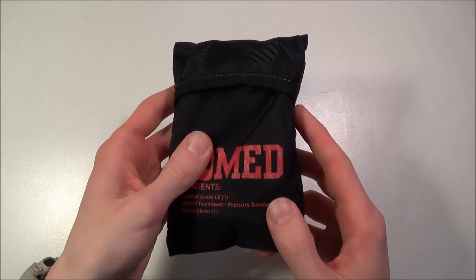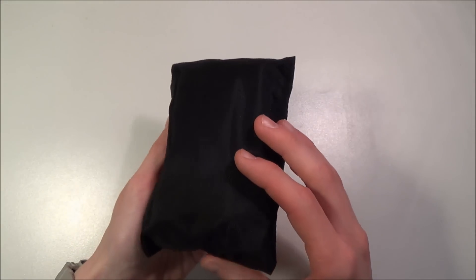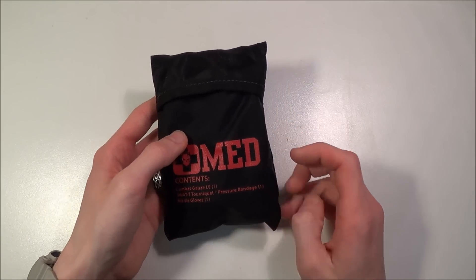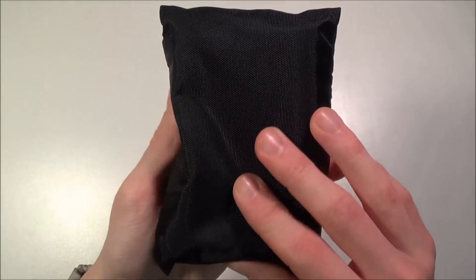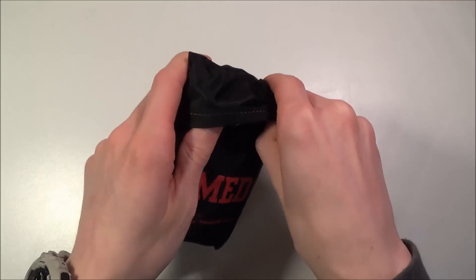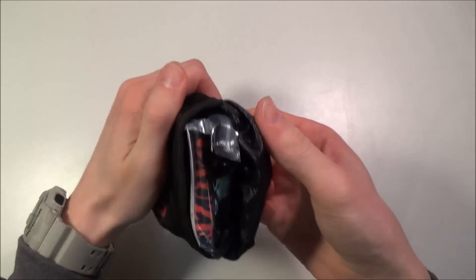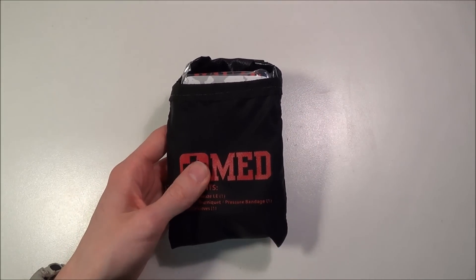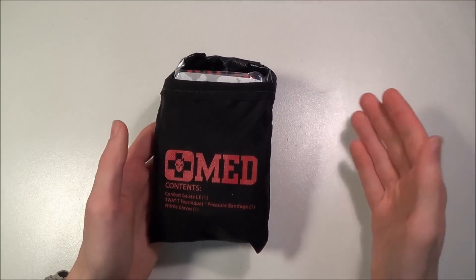You get this little nylon pouch. ITS Tactical also sells a nylon MOLLE-compatible pouch called the Slimline, which has a little flap with Velcro and is specifically for carrying this kit — also made by Zulu Nylon Gear. I actually ordered one of those a few days ago and it should be here tomorrow. When you order the EDC kit, you get this nylon pouch, which is waterproof and pretty nice, but my only complaint is that this flap-style pouch would be very difficult to open and access your items one-handed.